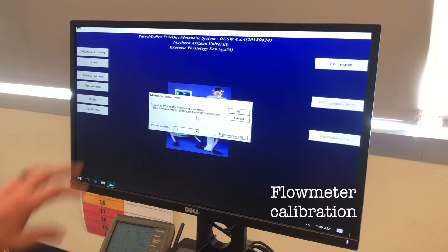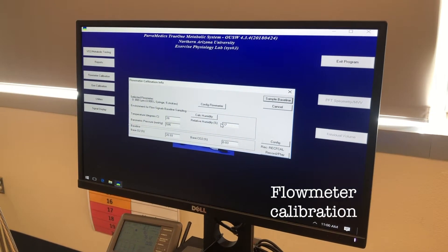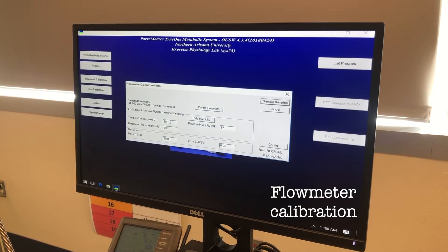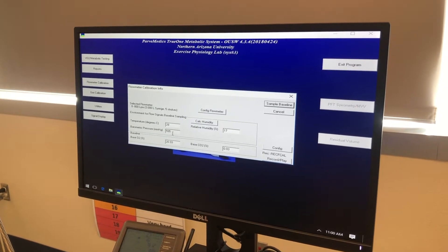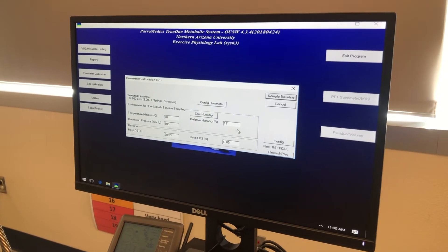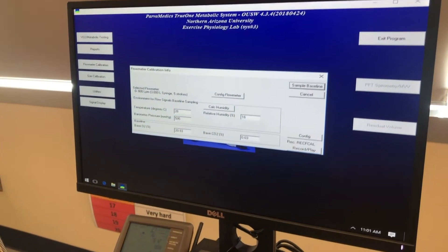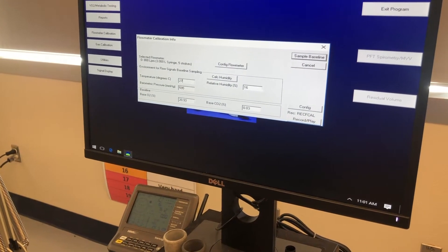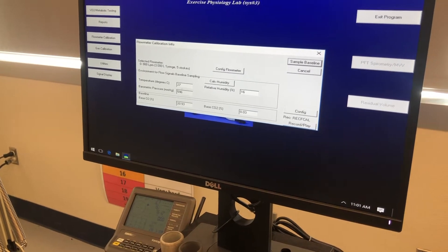A maintenance reminder pops up — we're going to click OK to ignore that. Then this window pops up giving you the option to change the temperature, humidity, and barometric pressure. We get these values from the readout on the panel: 16% humidity, 27 degrees Celsius, and 596 barometric pressure.